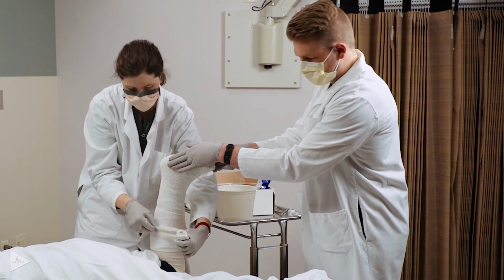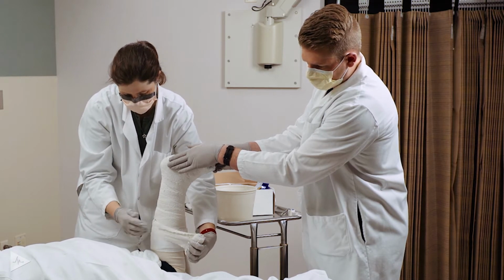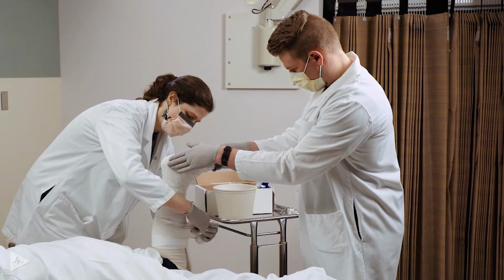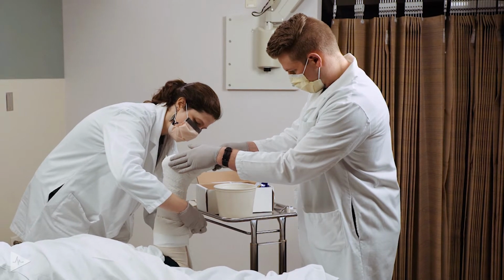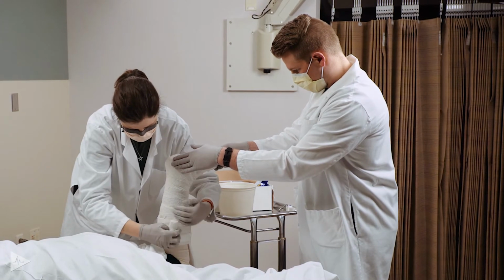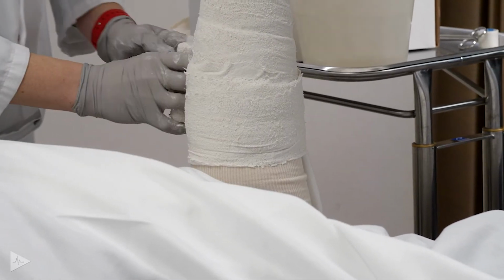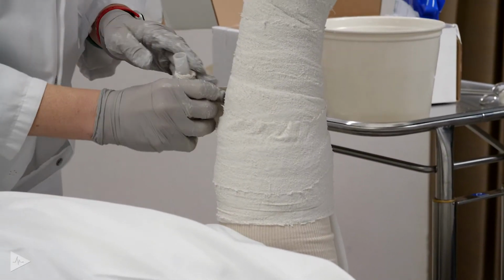If you start to get a gap here, you can see how that top edge is not adhering compared to the bottom because of the shape of the leg. You'll want to try to correct that over your area of padding. So that would be that front pad. And so you can form a fold on the front to bring that wrap back into alignment to continue. And again, I ended my padding approximately where I want to end the cast based on her calf size. And so additional plaster can just be brought back down the leg.